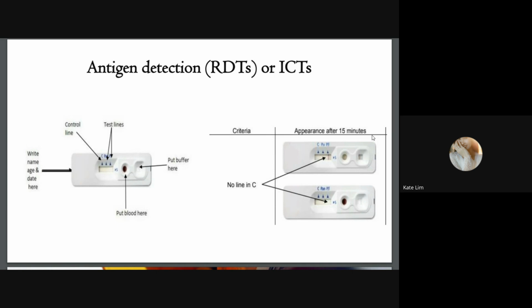Just imagine if you're in a remote village without a lab or a medical technologist, RDT would actually step in as a hero. We could tap trained volunteers to test and diagnose on the spot. So this is why RDTs are very important.